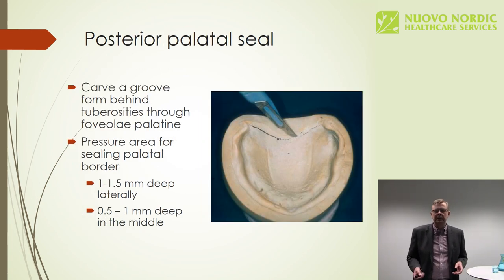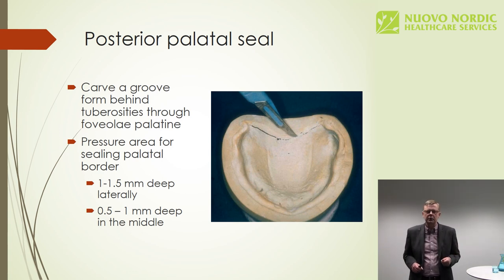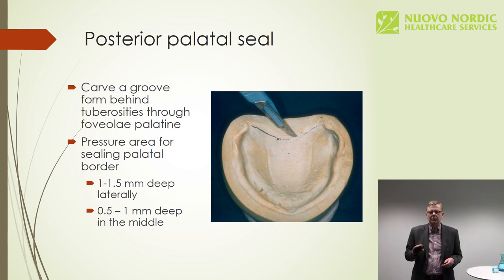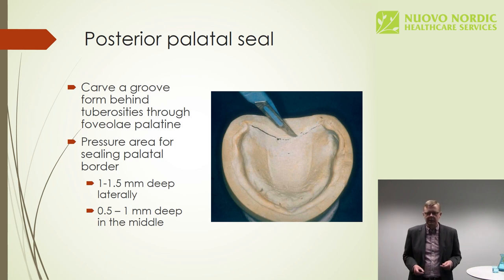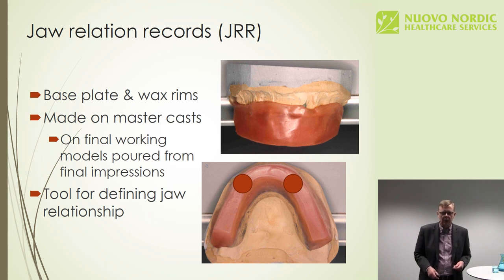Because in the palatal area there is no vestibule, we'll grind a groove palatally, transversally across the palatal tissues through the foveole palatini. It might be from 1 to 1.5 millimeters deep, perhaps a bit more shallow in the middle, because the palate is harder there. Anyway, in this way we'll seal also that part of the denture, and this is all for having the best possible suction cup effect. Okay, then we'll go into the jaw relations.